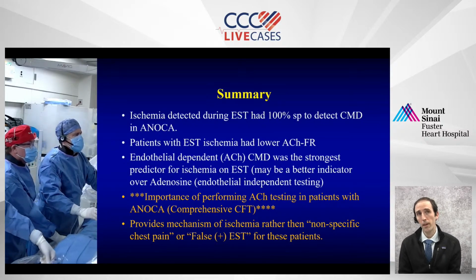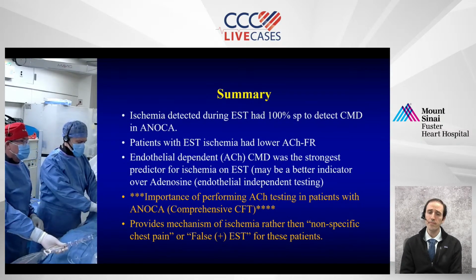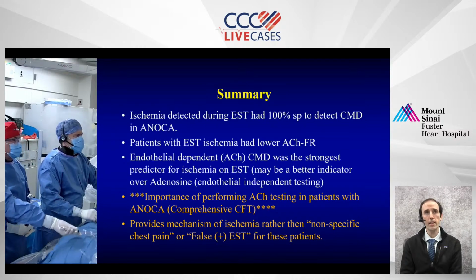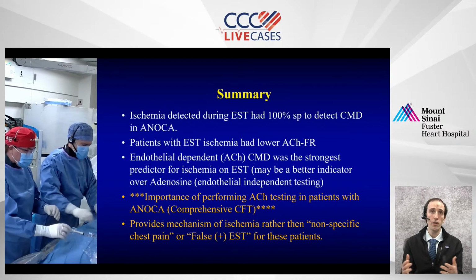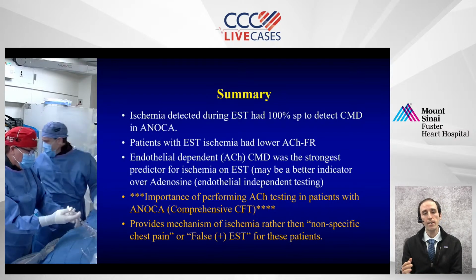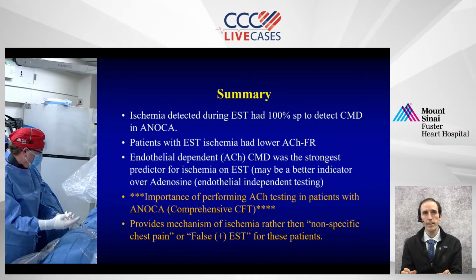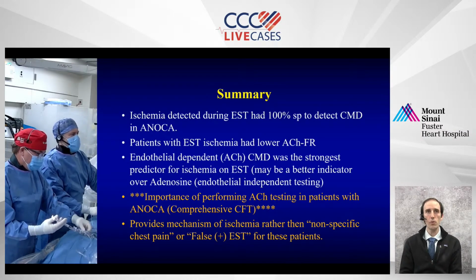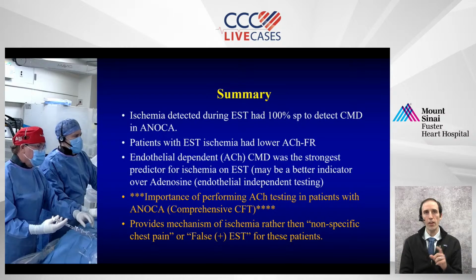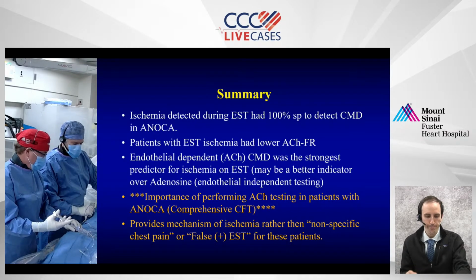And as far as the microvascular testing with adenosine versus acetylcholine measures, I think they're probably complementary, and I think we'll likely be moving towards, and I think we already have moved towards, comprehensive functional testing with both acetylcholine and adenosine. How that's done in 10 years, who knows how that will compare to how we do it today. But I think thinking of the diagnoses and starting your testing is really important.